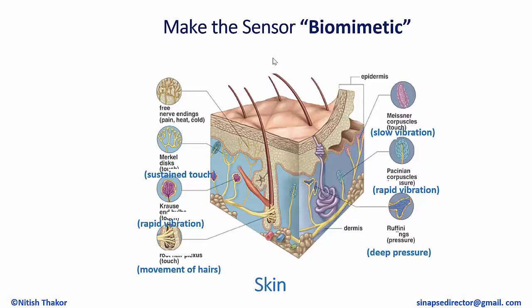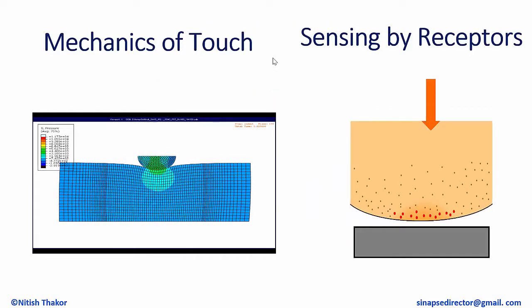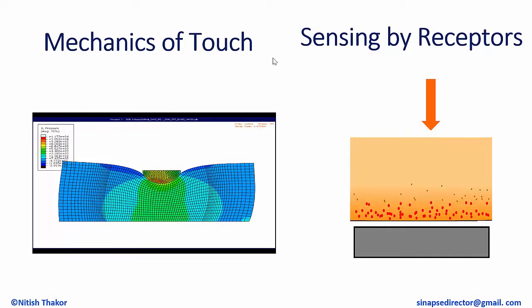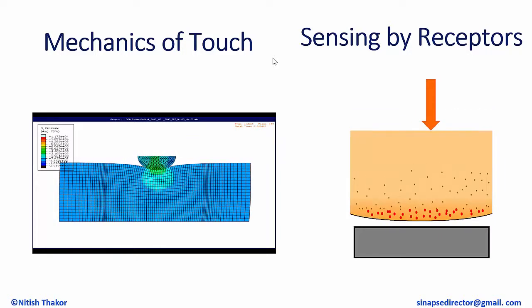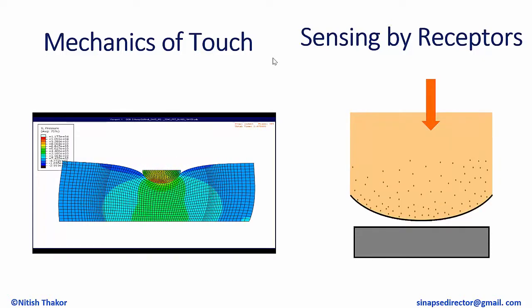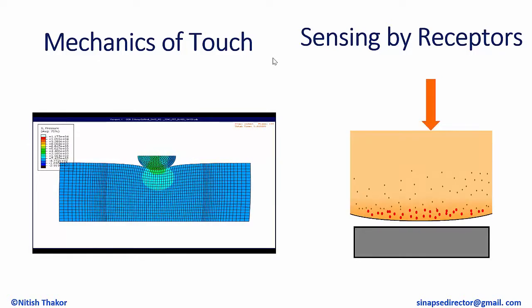These receptors are layered from top to bottom. So you can imagine ones at the top are a bit more sensitive, ones at the bottom code for something else. So that's what we want to mimic in e-skin. So when we apply a pressure, when you touch, when you press on the skin, the left side is that finite element model that shows that there is a deformation, and that activates those receptors. On the right side, those color dots show that therefore those receptors, so nerve endings, are going to start activating and producing some sensor signals.